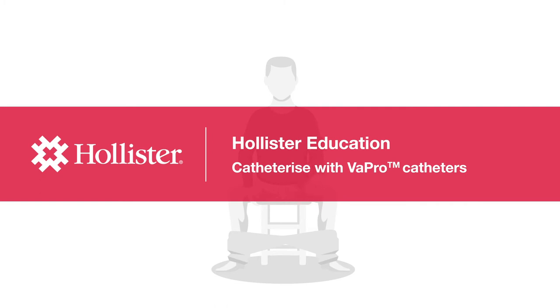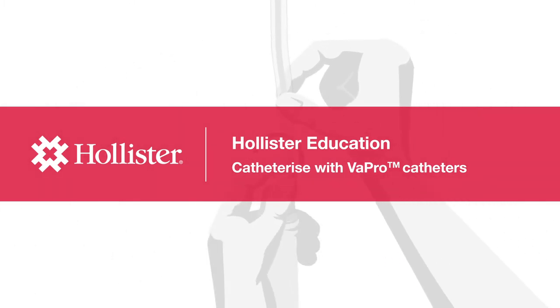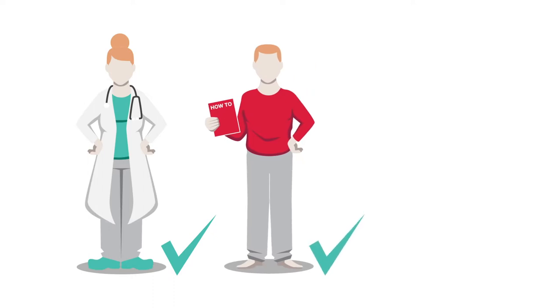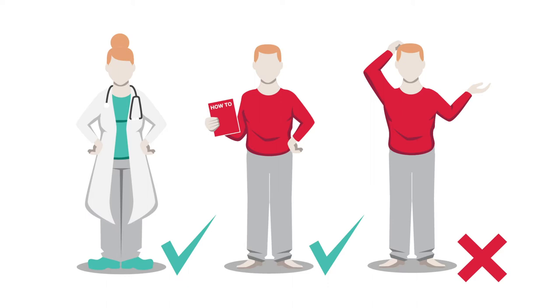Intermittent self-catheterization is performed by inserting a catheter, which is a tube to drain the urine, into the urethral opening and advancing it through the urethra into the bladder to allow the bladder to empty. Only people who know the correct technique for proper insertion and how to use the catheter should perform this procedure.